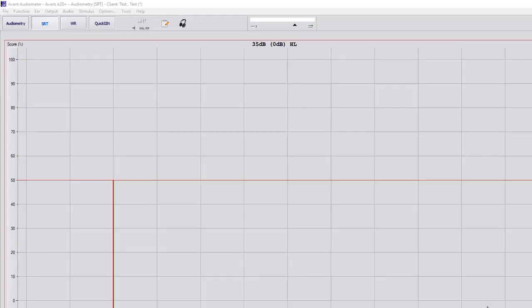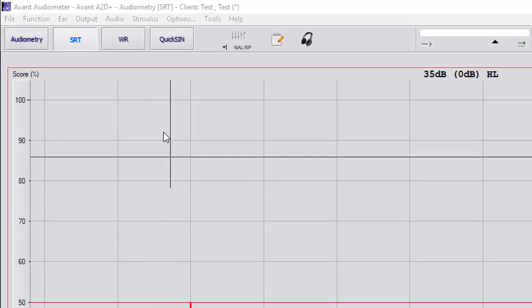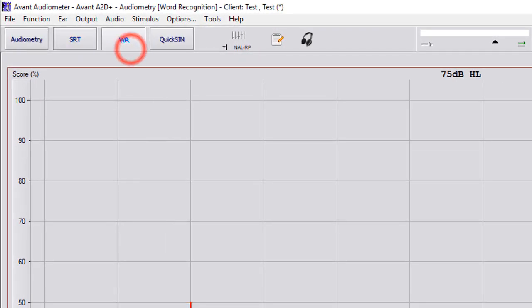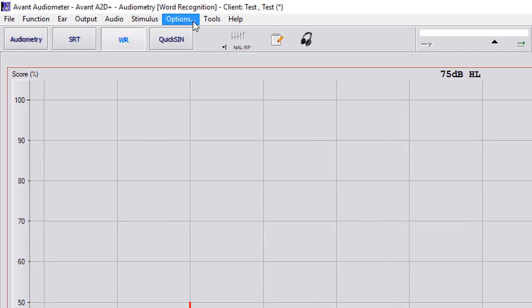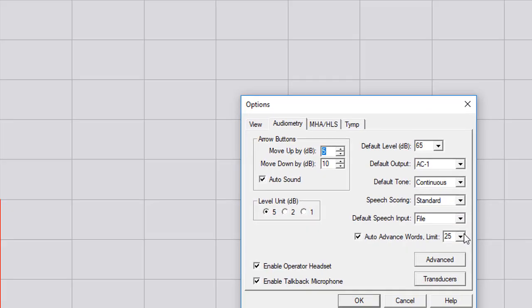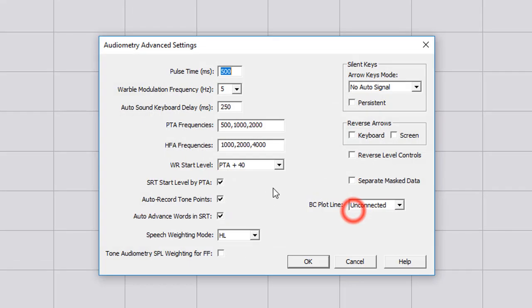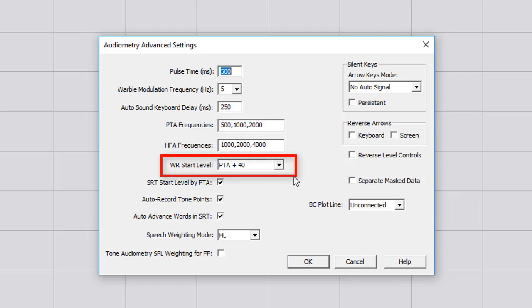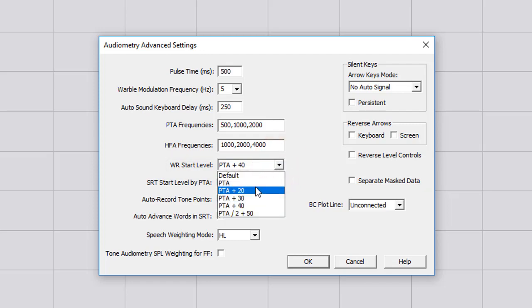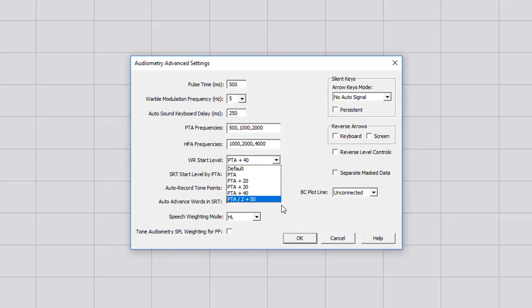Next, we have word recognition. As for your options, if we go to options here and we go to advanced, word recognition start level is going to be PTA plus 40. Now this is how it's going to be set if you don't do your MCL under word recognition. Most providers, if they're not doing MCL, feel like this is a little bit too hot so then they normally drop it down to PTA plus 20 or 30.